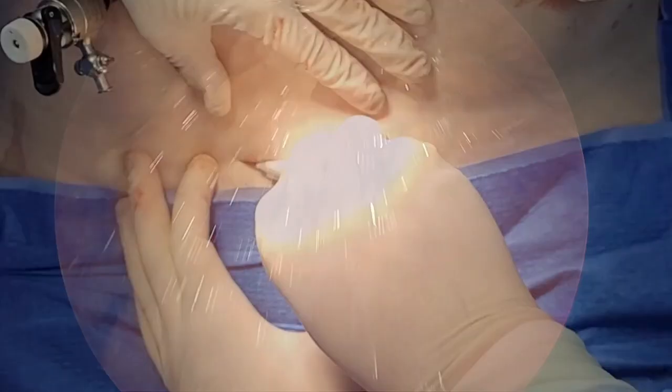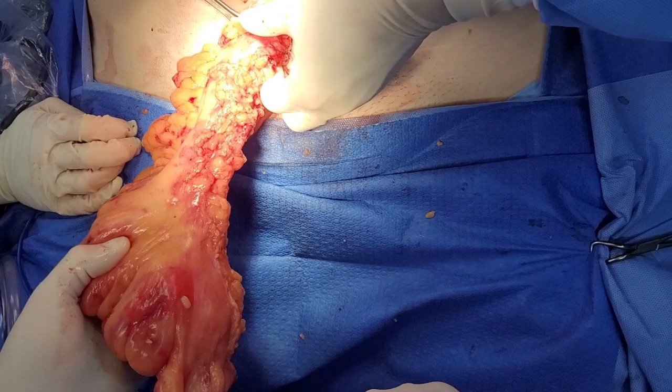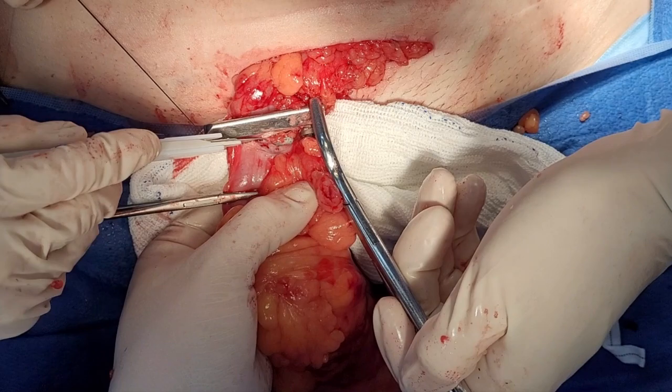A Pfannenstiel incision is made to extract the specimen. A purse-string suture is then performed, followed by proximal division. The anvil is introduced into the intestinal lumen, and the specimen is returned to the abdominal cavity, followed by closure of the aponeurosis.